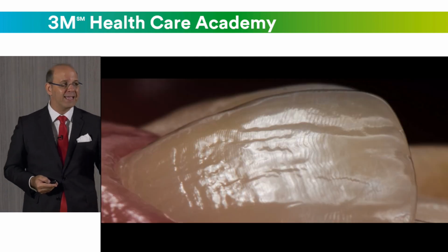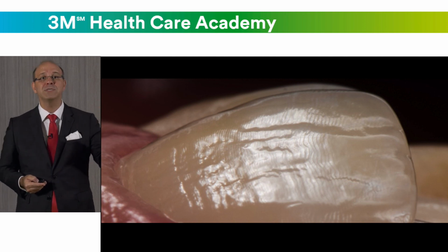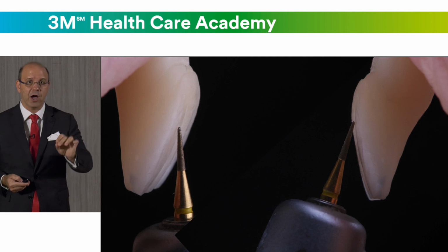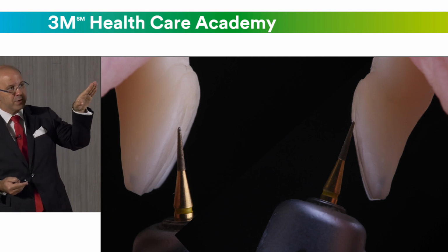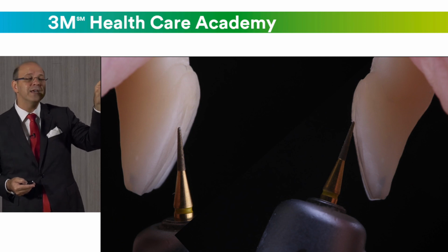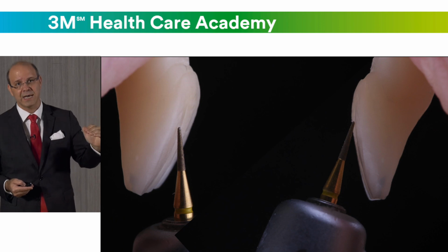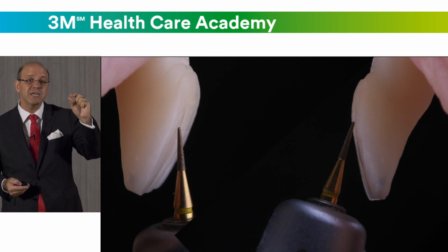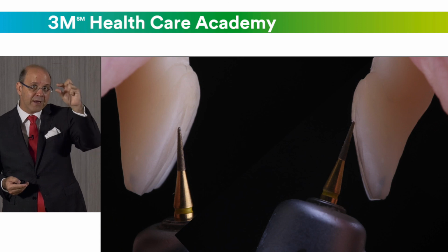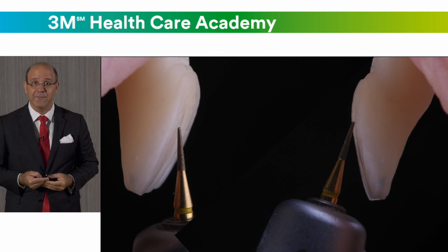If you want to replicate this natural effect, the perikymata, on the restoration, which kind of instruments can we use? Pick up the thinnest burr you have in your office, put it at 45 degrees to the tooth surface, and then you start to make very, very smooth lines from the cervical to the incisal third. The thinner they are, and the closer they are to each other, the more natural the outcome we will have.